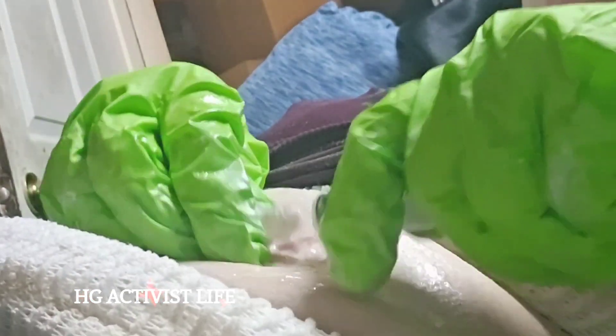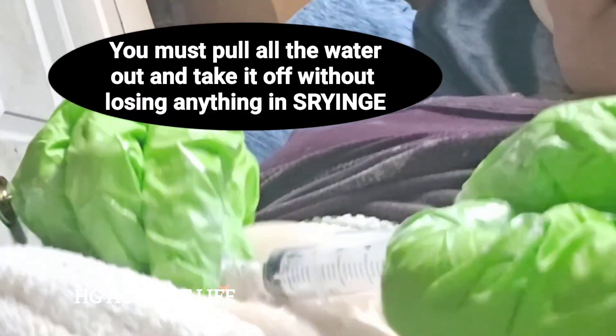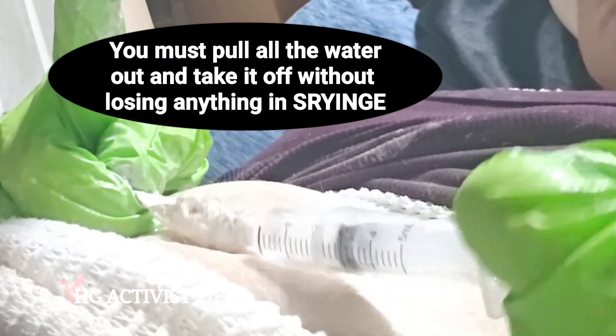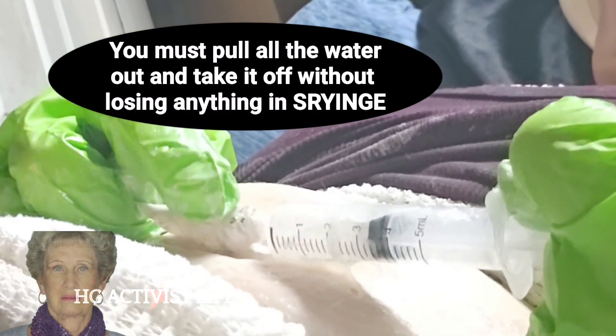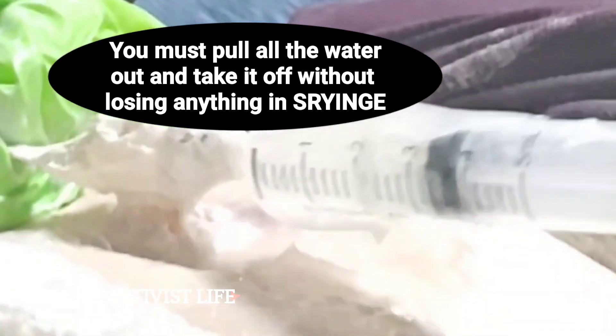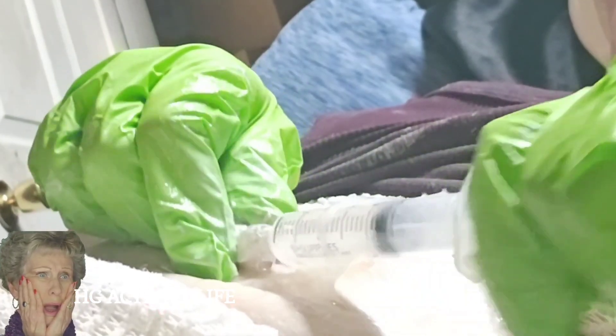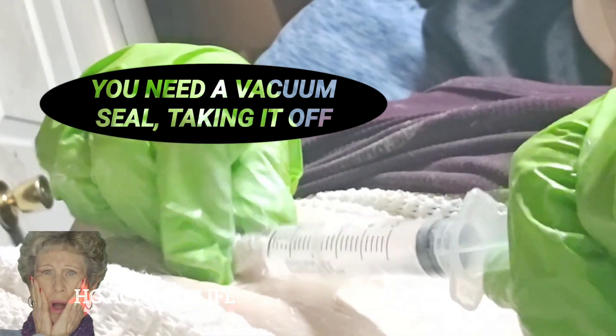The next step is you have to get a balloon syringe and pull the water out. If there's water on mine, it had no water because it had a slow leak in it, so you see me pulling it back — there's no fluid in it when there normally would be.